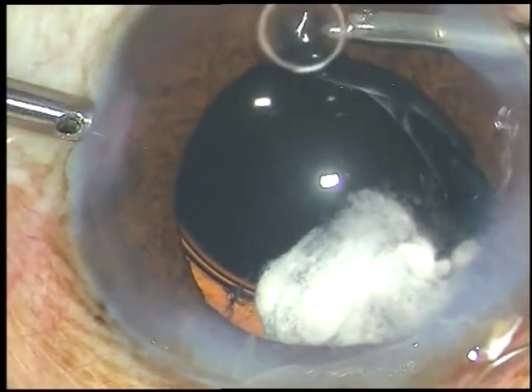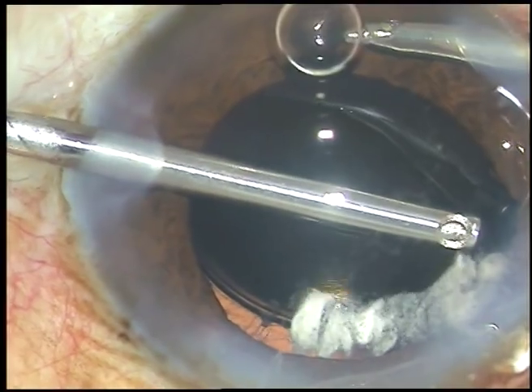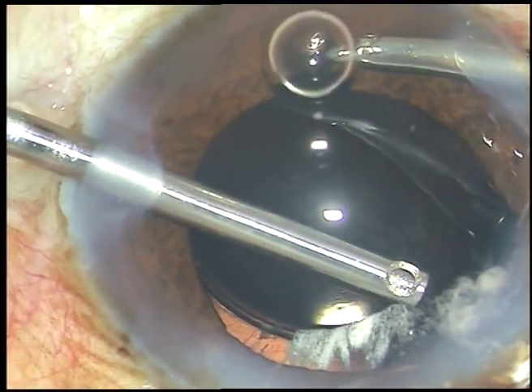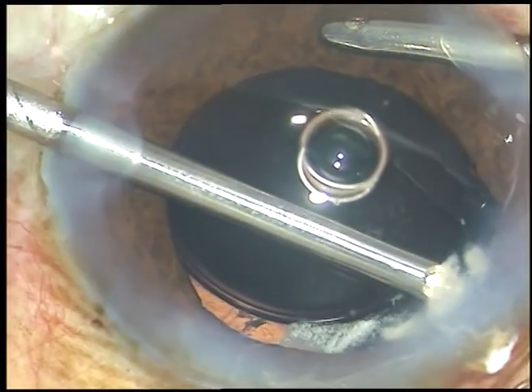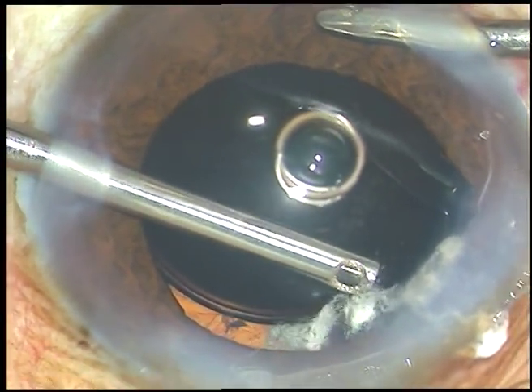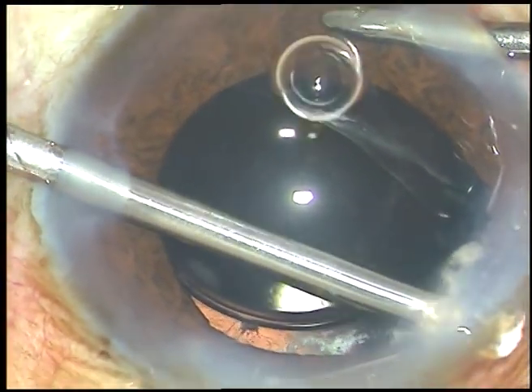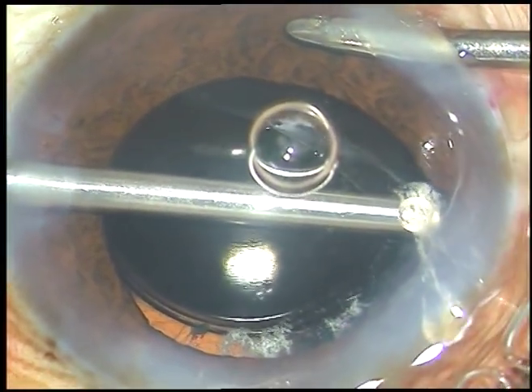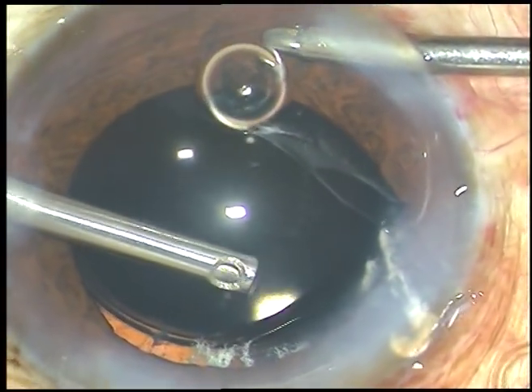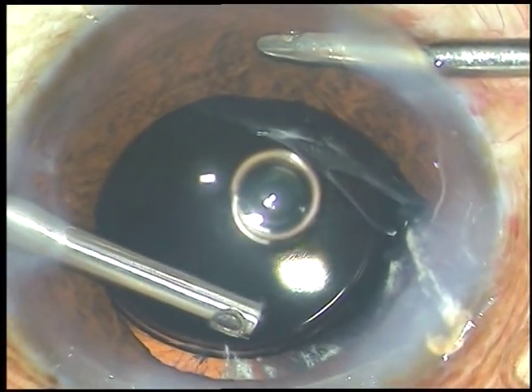See how beautifully you can cut the vitreous strands. The machine being used is an Oertly Catarix 3 pneumatic cutter with an inbuilt air compressor. The cut rate is 1200 per minute. I have to hook these strands — this portion of the vitreous is incarcerated in the main wound. To make it free, we must hook the vitreous strand and cut it at the pupillary margin.